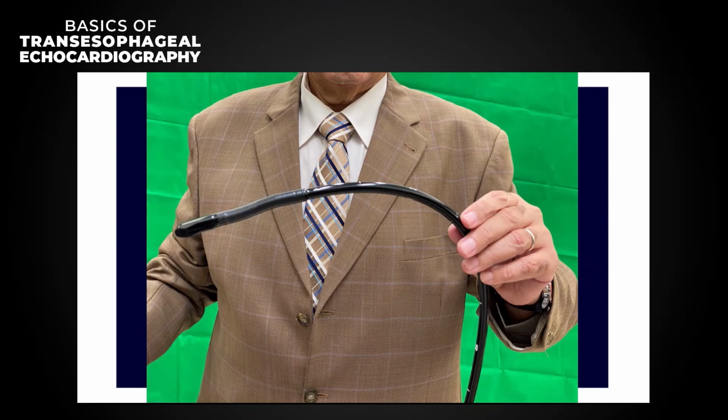Doppler color examination helps to assess septal defect and the state of agitated saline. Yes, I totally agree with you. Color Doppler helps you to detect the shunt flows and look for atrial defects and VSDs by color flow. But if you inject saline, why not? You can see a negative contrast. But as you said, Dr. Ali, it's the color flow.